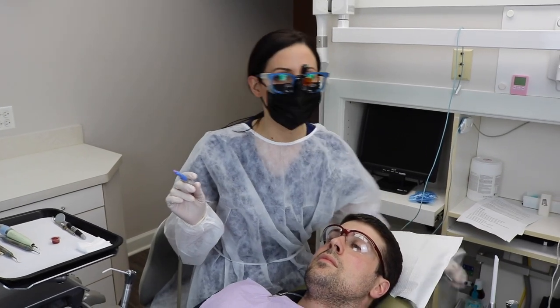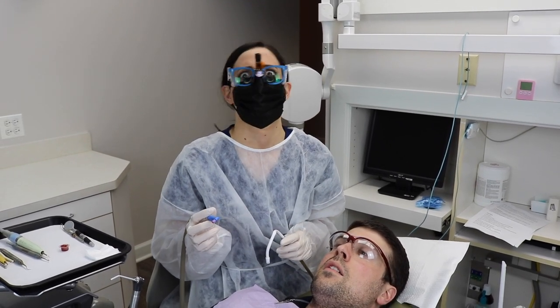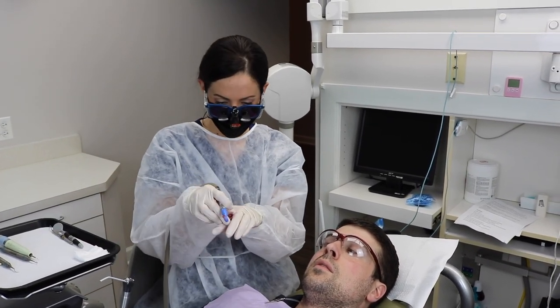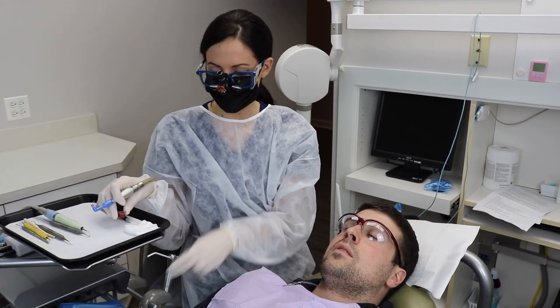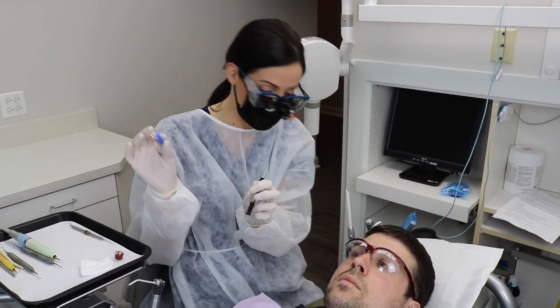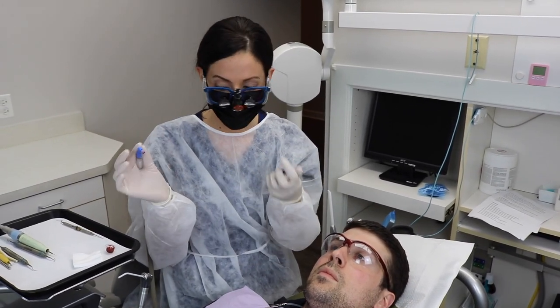I know some people keep the saliva ejector in the mouth the whole time — I don't do that, so that's probably not ergonomically the best. I don't wear a ring or anything; you know how some people do that. I just keep it really close to me on the tray and I grab it each time. It works for me — I'm very quick at it. Ergonomically, that's probably not the best; I should be wearing a ring.